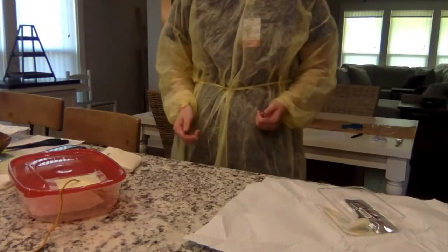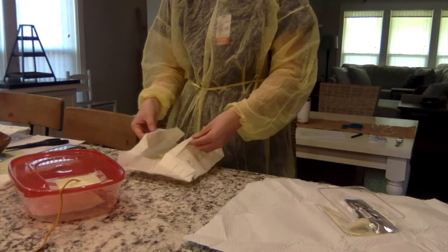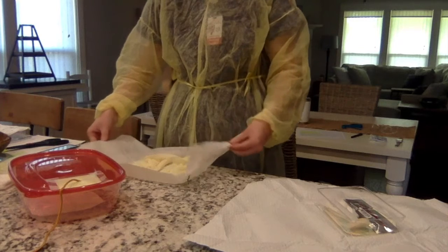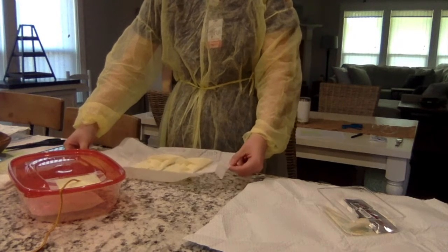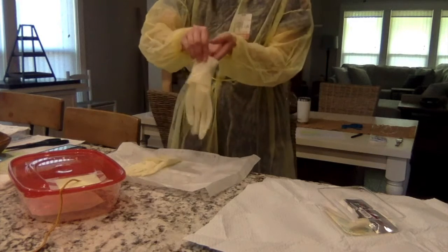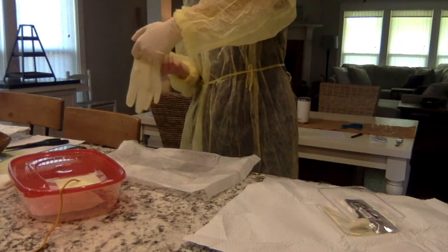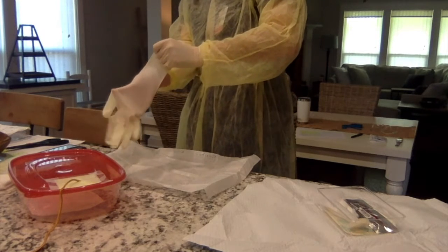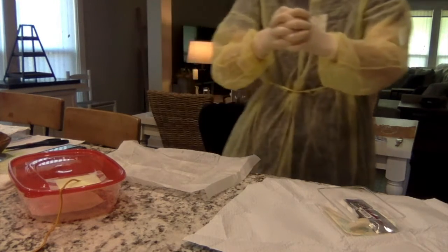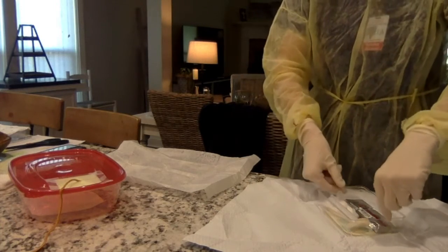So now that I have opened my kit using aseptic technique, I'm going to don my sterile gloves. So now that I have donned my sterile gloves, I'm going to come over to my sterile kit and I'm going to arrange my contents of my kit, making sure I don't go past the 1-inch border.